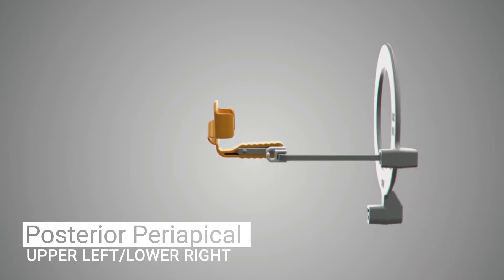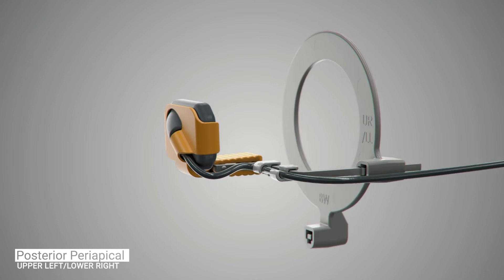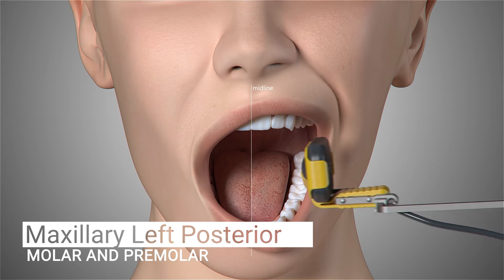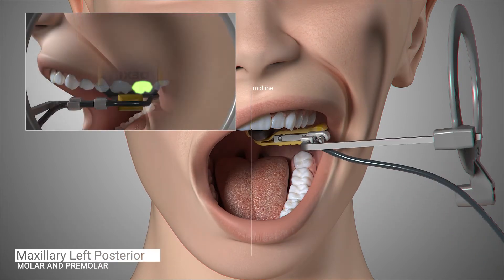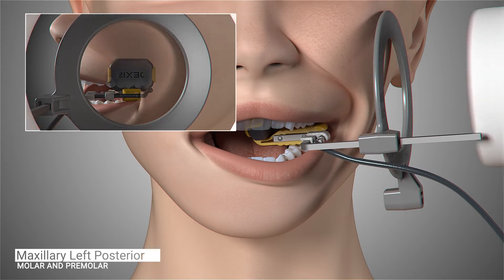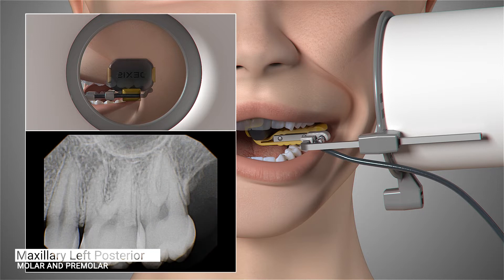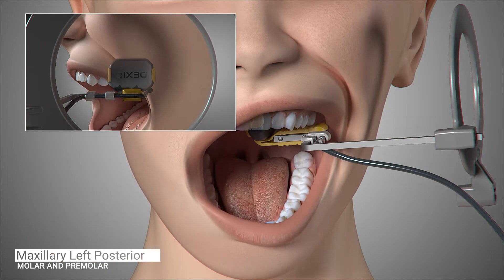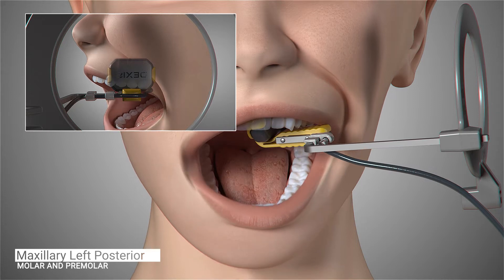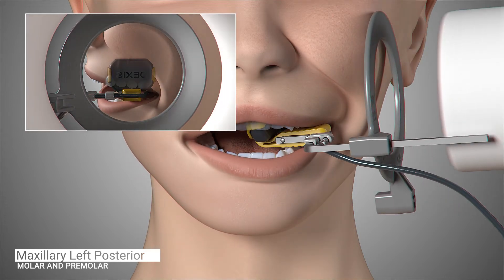The configuration of the sensor and holder will change for the next set of images in our series: the maxillary left periapicals. Position the sensor in the patient's mouth toward the midline of the palate, parallel to the roots of the molar and centered on the second molar. Ask the patient to close and slide the aiming ring as close to the patient's cheek as possible. The cone of the x-ray emitter must be placed flush with the aiming ring and then trigger the exposure. Ask the patient to open slightly and gently slide the sensor forward so the contacts of the first and second premolars are centered on your sensor. The sensor should be placed far enough forward to capture the distal of the canine. Ask the patient to gently close, position the cone of the x-ray emitter and trigger the exposure.